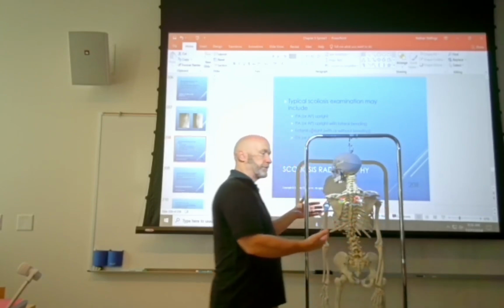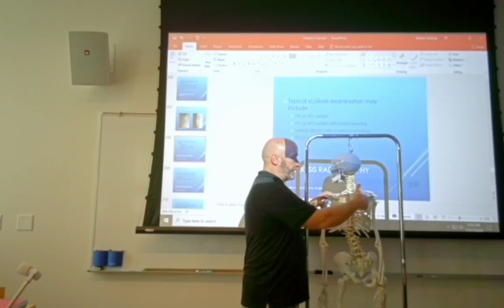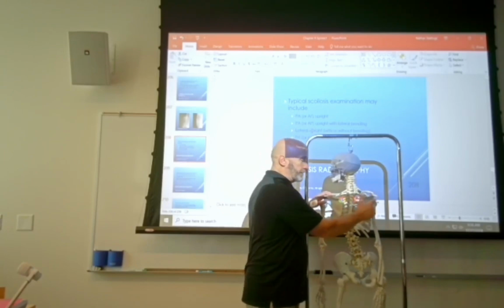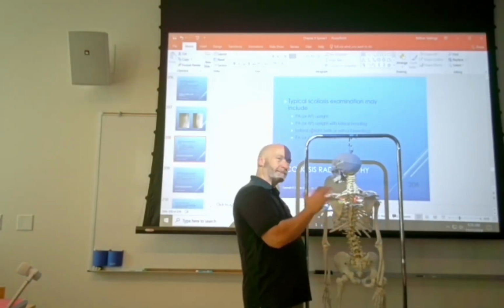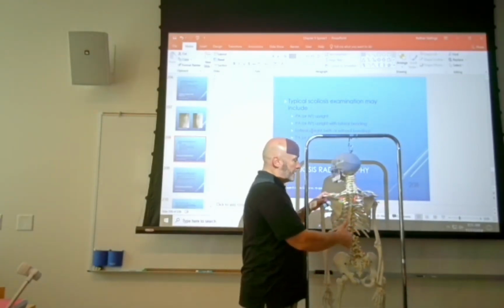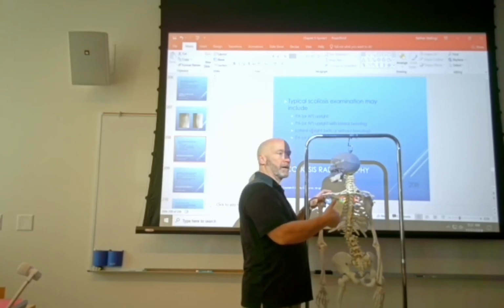The purpose for that is because if the scoliosis is pretty great, and even if you position directly in the center of it, if it bends out too far and overlaps a part of that wedge, you don't want the fat part of the wedge covering the spine, because then you can't measure it, right? So they want the skinny part so that there is a little bit of latitude, a little bit of forgiveness in it. So wedge filter, 72 inches, PA projection.